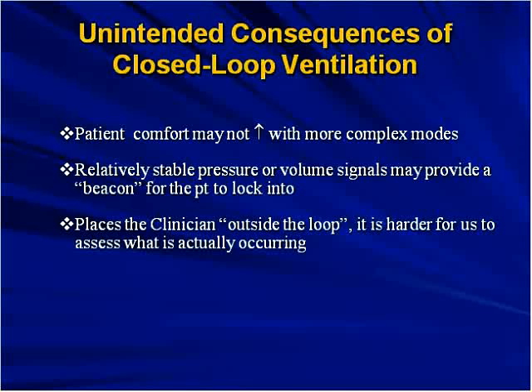In terms of I time, for normal people our I time is like 1 to 1.5 seconds. Critically ill patients generally don't need that long of an I time. So again, keeping it under 1 second, around the 0.7, 0.8, maybe even 0.9, is probably a good place to start, and will help take care of some of these problems before they start.